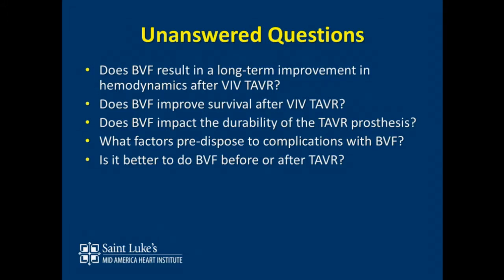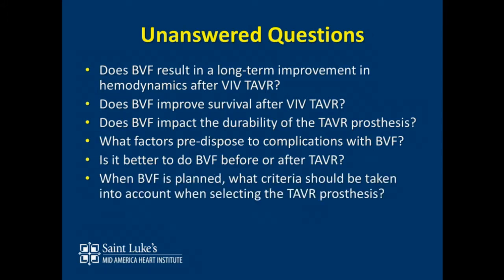There's always the issue in a bioprosthetic valve of doing a valvuloplasty causing severe AI and then the hemodynamic issues that come with that. So that's one of our concerns. And then the theoretical complications of embolic debris from the degenerated valve. It's theoretically possible. So maybe putting in the TAVR valve first to kind of seal that off before you do a high pressure inflation might be beneficial. So that's our thought, but we don't know the answer.